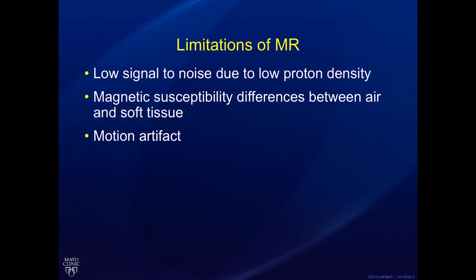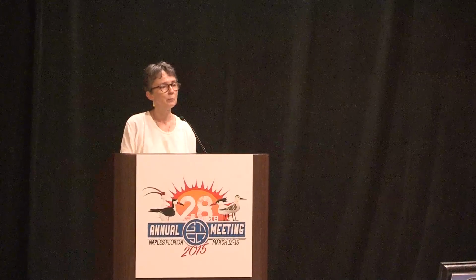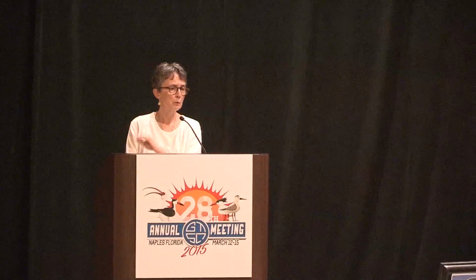What are the limitations of MR? Before I started working on this talk, if anybody had called me, my clinicians, I do pediatrics, and said, I want a lung MR, I'd say, oh no, you don't want a lung MR. We'll do a chest CT, and then we'll do an MR for these other things, but you can't see anything on lung MR. But I found that I was wrong, and so now when they call me, I'll say different things.